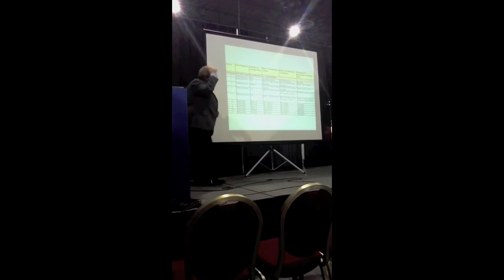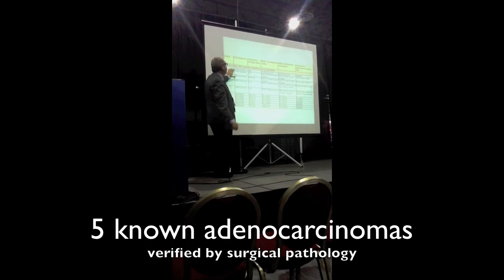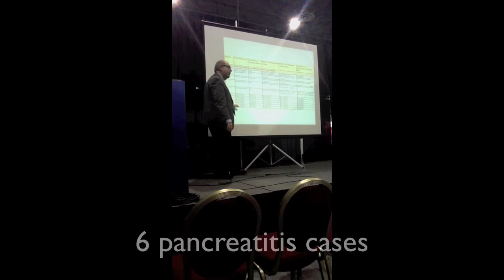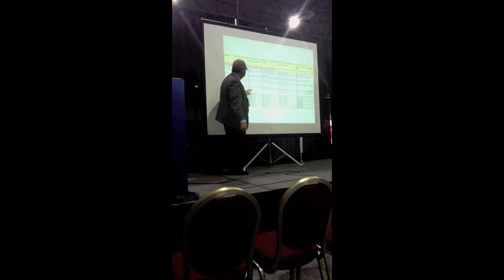So what we did was, first we did a small training set. We took a series of known adenocarcinomas in cytology, so there wasn't any doubt, and also a series of pancreatitis, negative specimens. These were all patients with confirmed clinical status. And we looked at the cellularity.